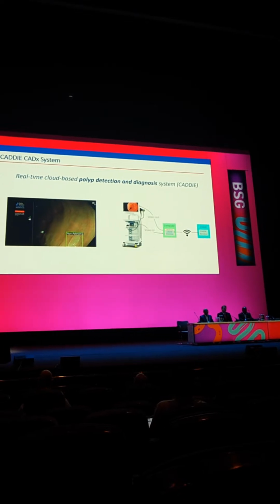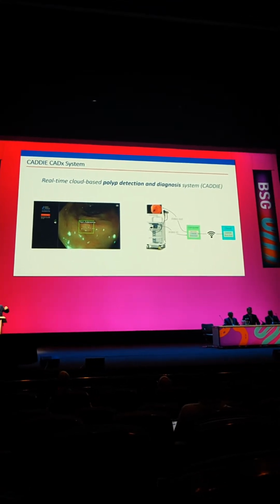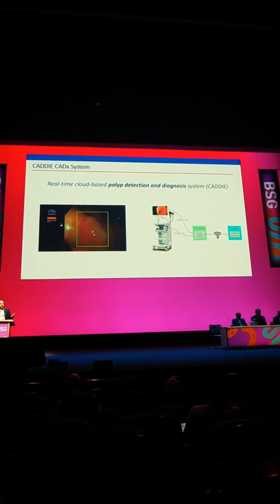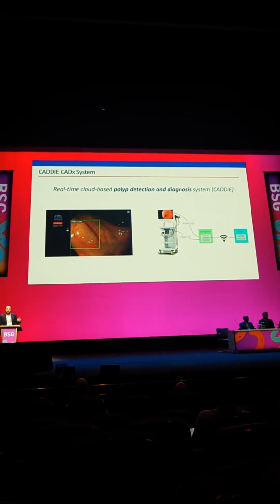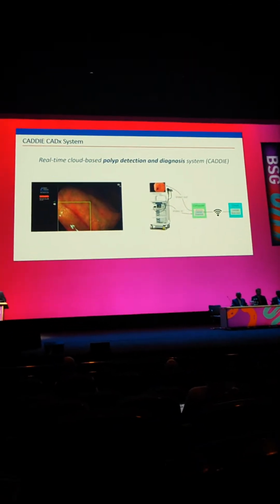Whereas what we do here is we use this cloud-based format. Image data is sent from the stack to the cloud using the hospital's internet infrastructure. It's within the cloud that the AI algorithm resides. It processes these images in real time, and then if appropriate, it feeds back the bounding box or the predicted diagnosis for CADx.